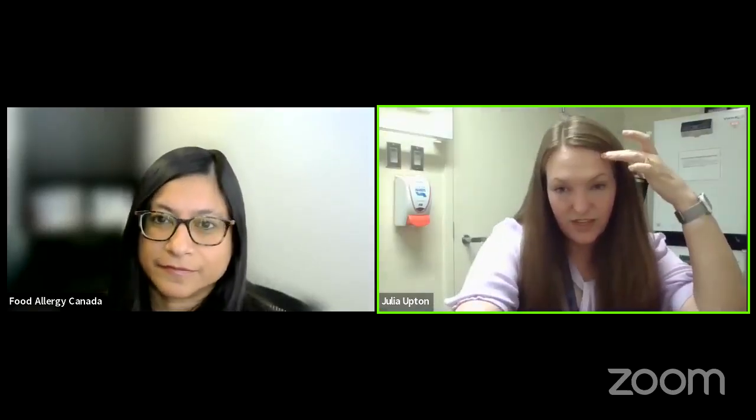So I think that's super helpful. I would love people, and you mentioned at the beginning, I would love people to practice with their devices, practice with the demo, and just think about how you would give it. I really want to highlight you don't need to touch the back. You're not pressing a button in this. Neither one are you pressing a button. You're triggering the device by pushing it onto the leg. That's what triggers it. Yeah.